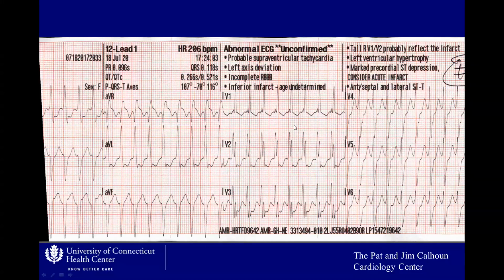Dr. Schmitt, I have a question. So you can see, I know it's VT, so the criteria for LVH, can we apply it on this, because aVL is like, no, it's a voltage criteria, so not during the tachycardia you can't, no. Right. Yeah. All right, guys.